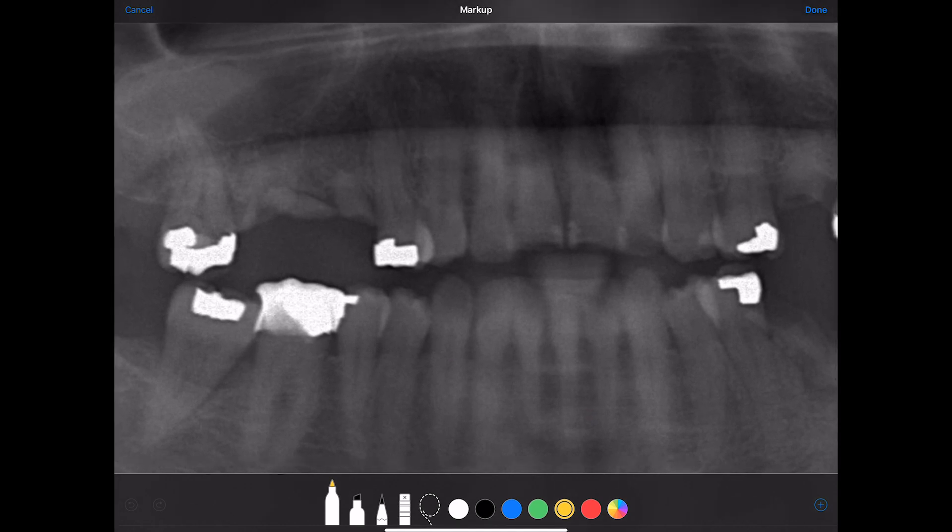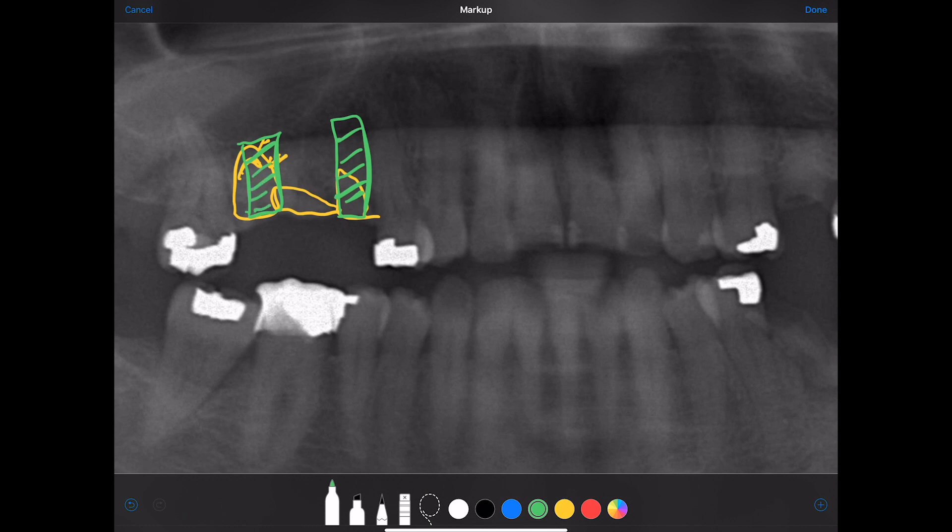Starting up here, we've got some root tips to be extracted. I'm not entirely sure where this root ends — whether it ends right here or right here. By the looks of it we still do have room to place implants. This one over here I'm not so sure about, and then we could do a little bridge over here.